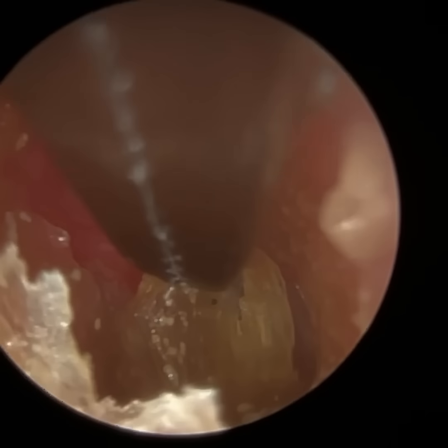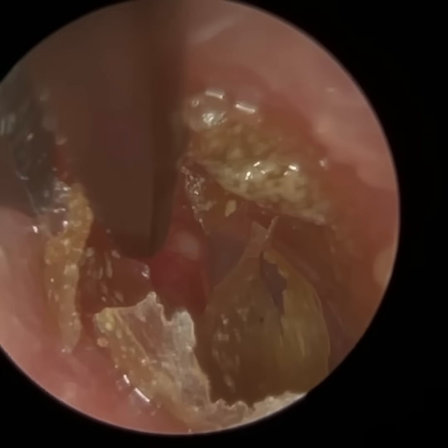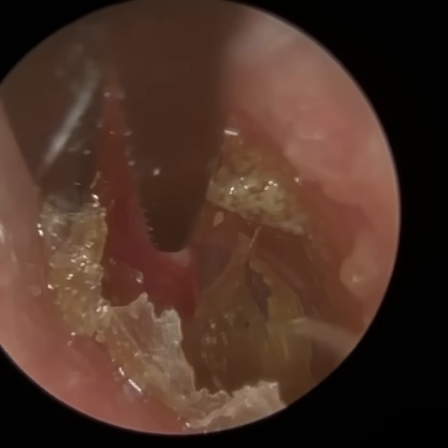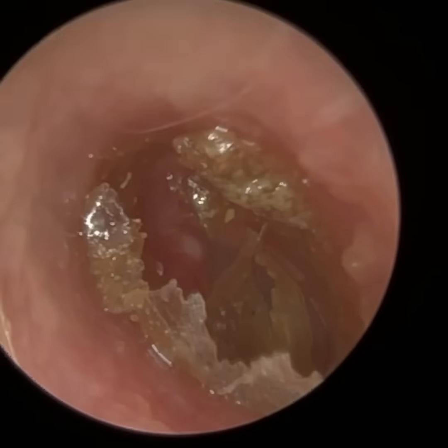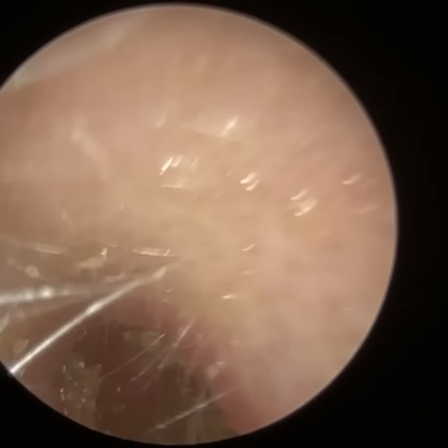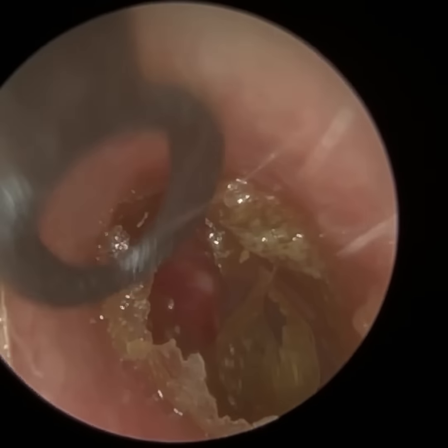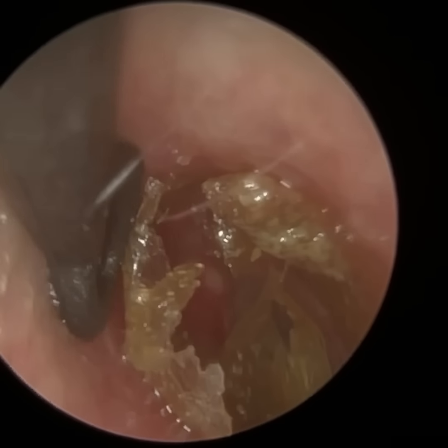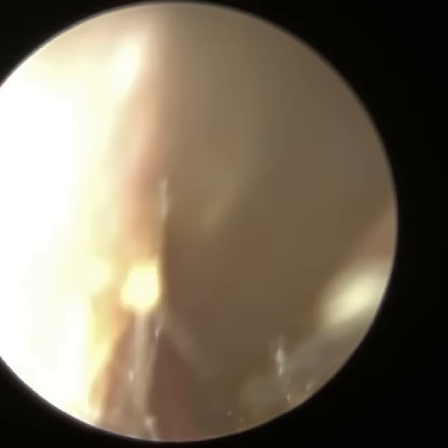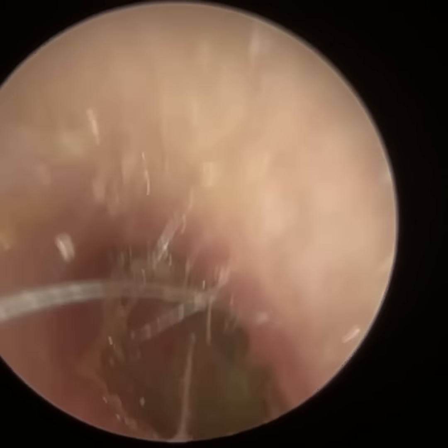There was a moment where it was slightly uncomfortable for Matthew. You can see only the short process of his malleus — you can't really see most of the eardrum now. At that stage I was going to try and peel that segment off the eardrum, but these are micro forceps and it's just very tricky getting them that deep in the ear. I pre-warned Matthew that I'm going to go on the bony part, and you can see I separated it but he flinched slightly, so I just came away.